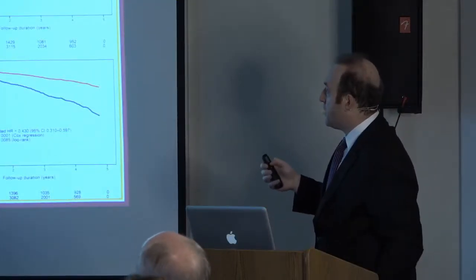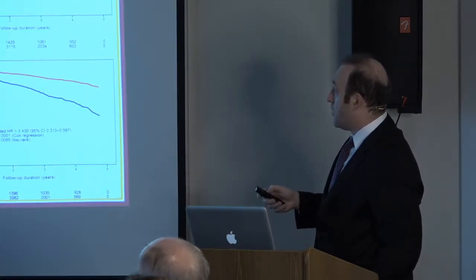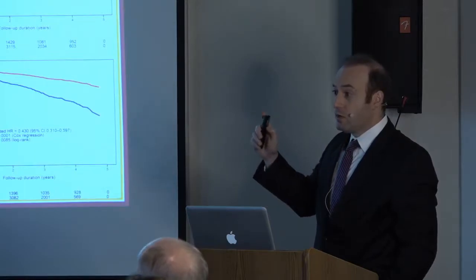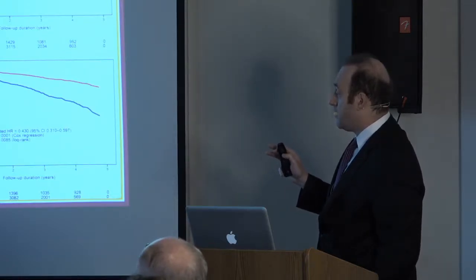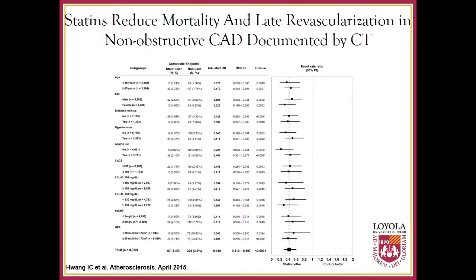And what they found was that there was a statistically significant reduction in both overall mortality as well as downstream revascularization, whether it be with percutaneous coronary intervention or bypass surgery, in those that were on statins. And that was irrespective of the underlying clinical risk factors. So the unique opportunity to intervene on these patients with non-obstructive disease and reduce their downstream events. Again, no other functional non-invasive stress test can identify those patients.